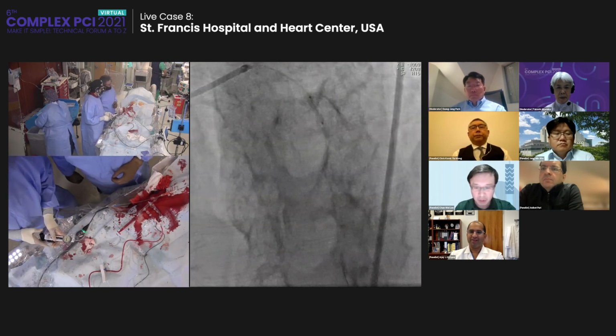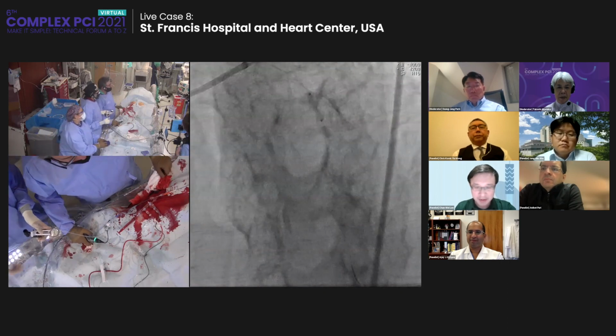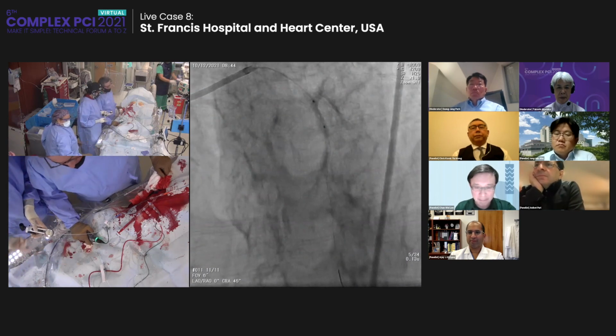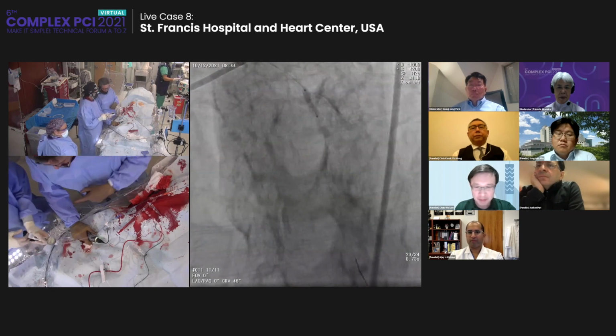Okay, we're up at 4. So we're going to shock now. We've got that 3.0 there. So obviously you can see it's completely yielded already. Yeah, just with 10 pulses. So we're going to use all of our pulses as best we can.